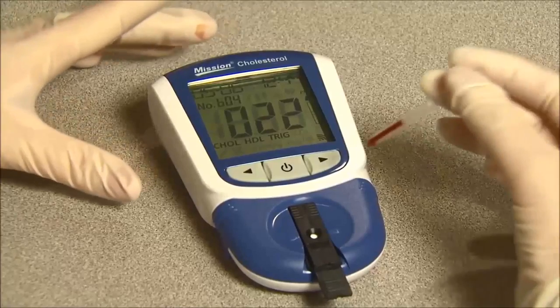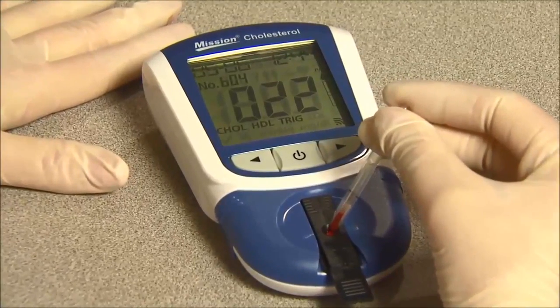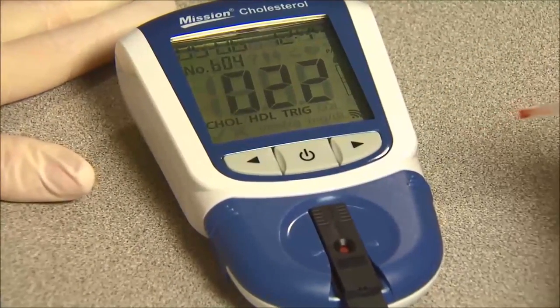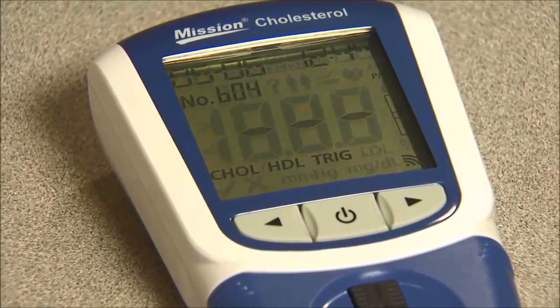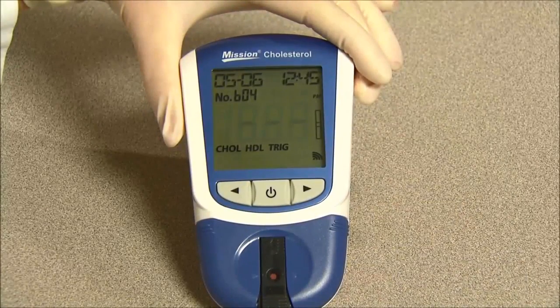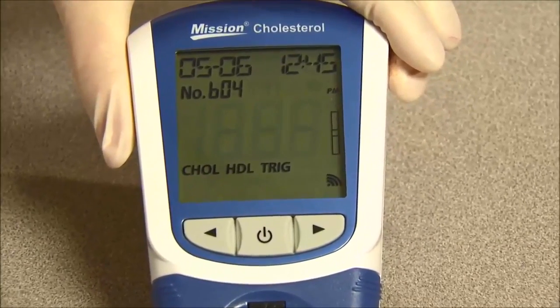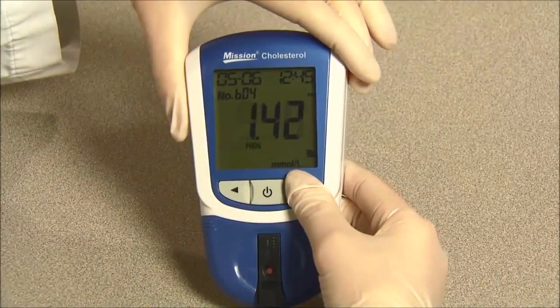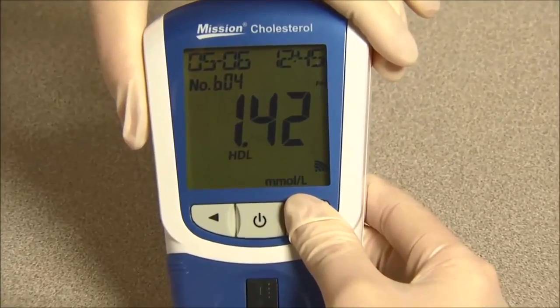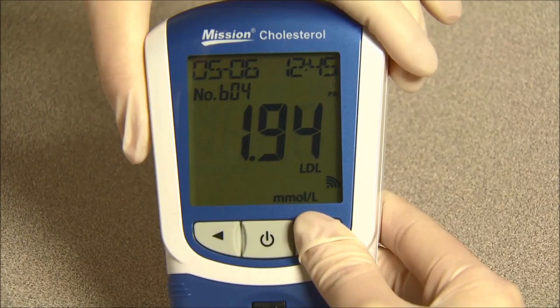Apply the blood sample to the center region of the specimen application area of the test device. The meter will begin testing automatically, with three dashes in a line flashing on the display indicating the test is in progress. Results will be displayed in 45 to 120 seconds. Press right or left to view other 3-in-1 test results. The meter will automatically turn off after 5 minutes of inactivity or when the power button is pressed.